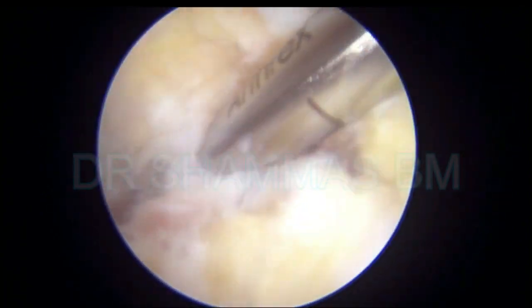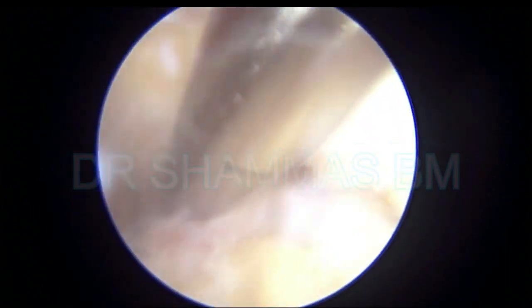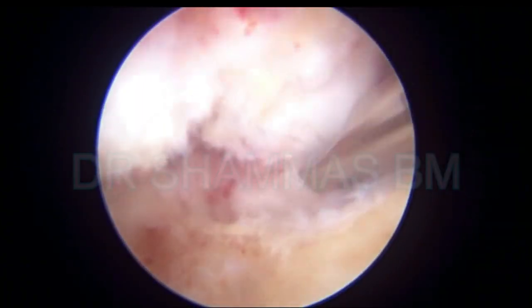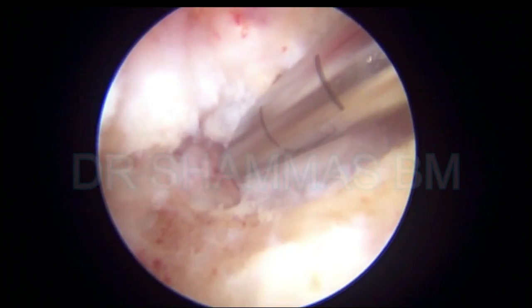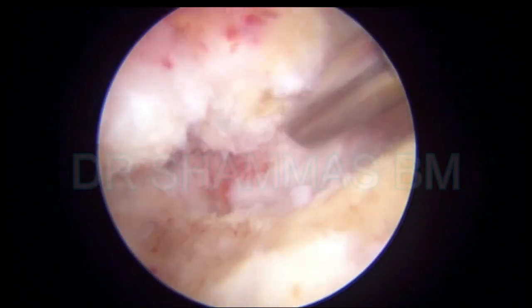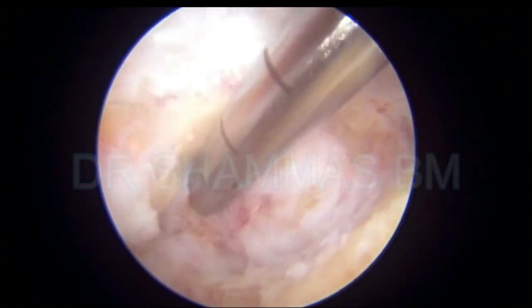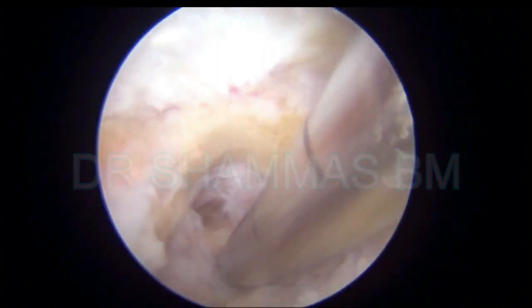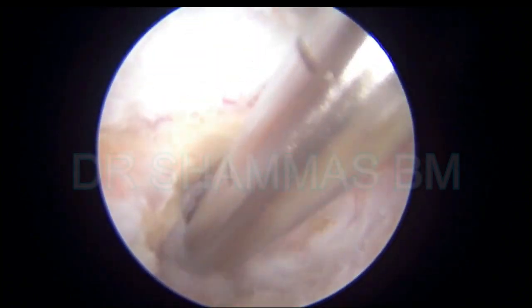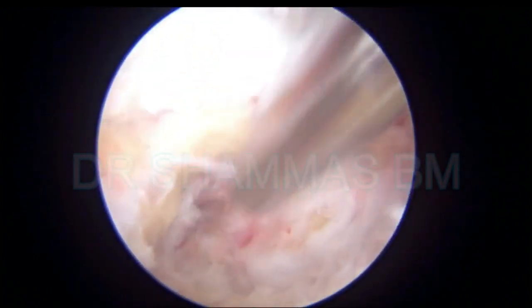The fibrosis, the scar tissue, the cartilage — everything should be removed. Slowly and steadily we are seeing the bone, and you can see that the gap between the tibia and the talus is increasing. Now this is the tibial side that I am removing. The soft tissues on the tibial side are being removed — soft tissue along with the cartilage and fibrous tissue.